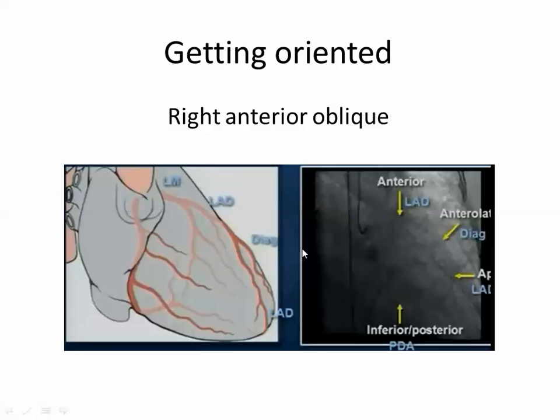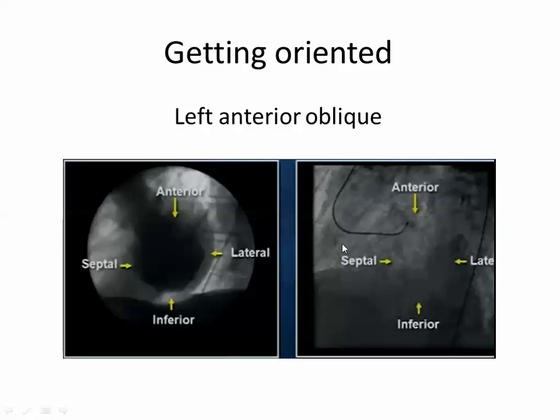It's clear? Anterior, it's the apex and the sternum, and this is the posterior, while here it is right and left, okay. So it is septum, anterior, lateral, inferior. So where is the position of the LAD you will expect? Here or here? Here on the septum.